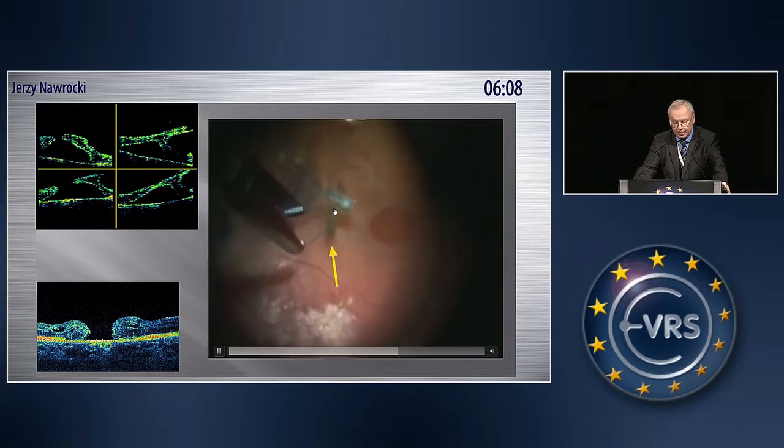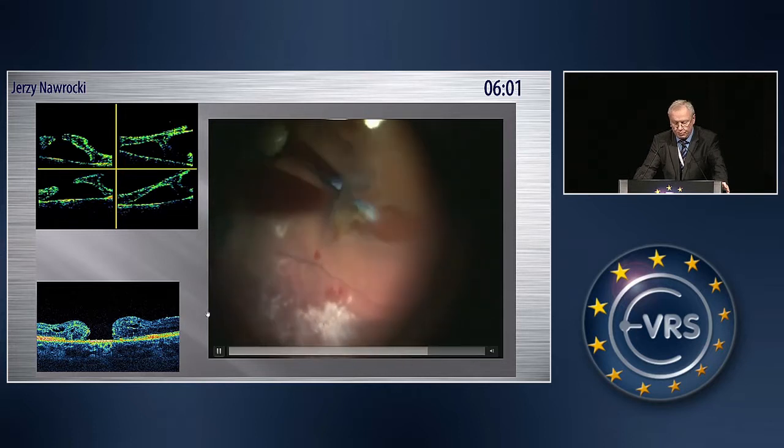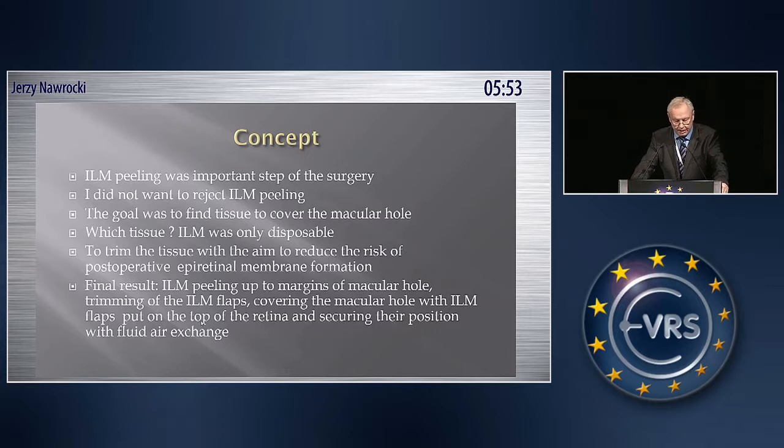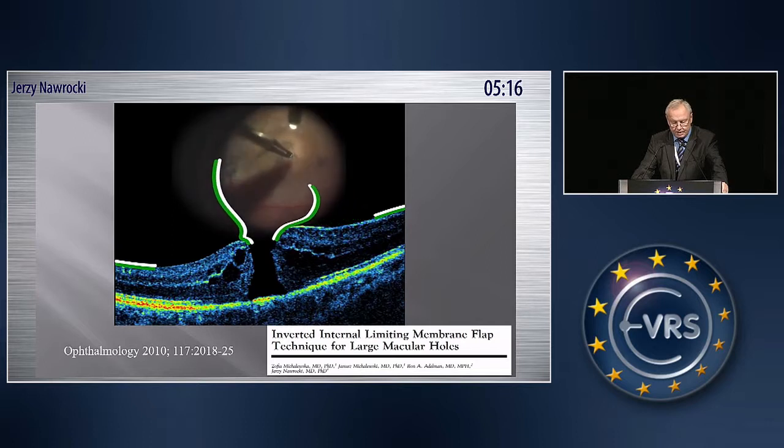I don't know what kind of tissue it was, but finally the case ended up with a flat open macular hole, or type 2 macular hole, and actually I do not like this type of closure, so I began to think, what can I do? And actually I found that the only tissue I can use for improvement of my technology is the ILM. I was afraid of everything we said today, that ILM is a scaffold for epiretinal membrane formation. So I peeled ILM up to the margins of the macular hole, did not remove it completely, trimmed it to reduce the risk of epiretinal membrane formation, and covered the macular hole on top of the retina surface.